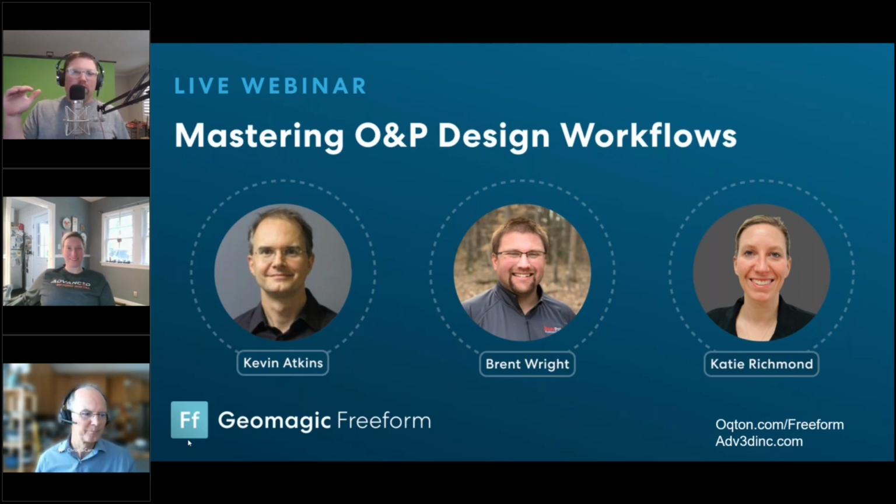What I would suggest is really to dive into what part needs to be strong. You do an FEA on those particular parts, and then be consistent using those parts when you're making your prostheses. So for us, what we have done the analysis on are the distal ends and how it actually connects. So for instance, when Katie was saying that we loft in more of a flat surface rather than a reverse curve, that is because the strength was so much better when you have a loft versus the reverse curve. And so we now have made that a standard practice in the way that we make our sockets.